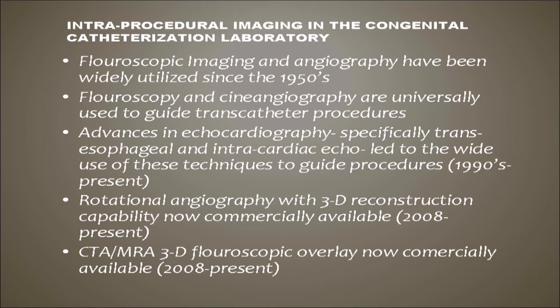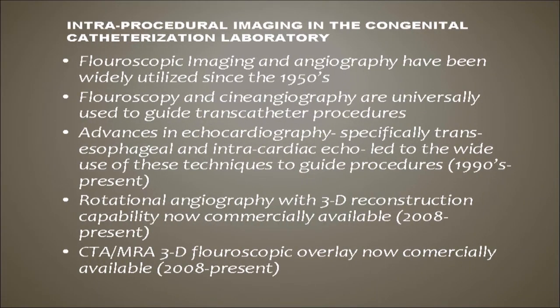Advances in echo, specifically Trans-Esophageal Echo, and to a certain extent intracardiac echo, have also led to the wide use of these techniques to guide procedures. And closing an ASD these days, you're not going to do it without intracardiac echo or transesophageal echo. Rotational angiography with 3D reconstruction capability, which is now commercially available over the last few years, and I'm happy to say we've been able to install those systems at UCLA and use them, and I'll show you how those work. But that's the next level. Those beautiful CT images we can now actually import into the cath lab and overlay them on the fluoroscopy screen and do a case live while we have the model of the complex heart sitting there. So again, makes our procedures safer and allows us to do more things.